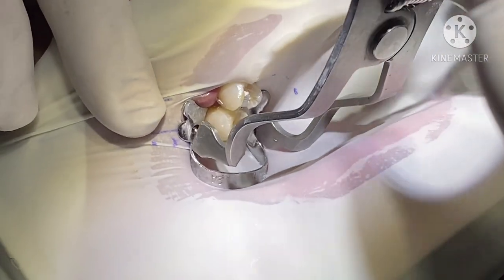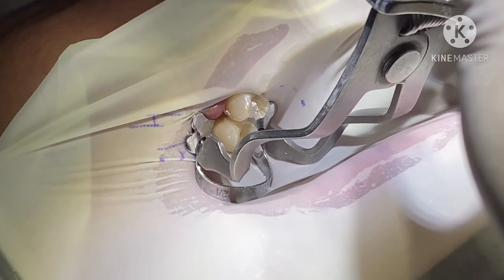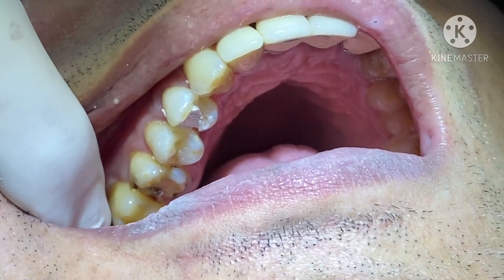Now after doing the temporary filling, we put the prongs into it and expand it, and here it comes out. You can see that the temporary filling stays in position.